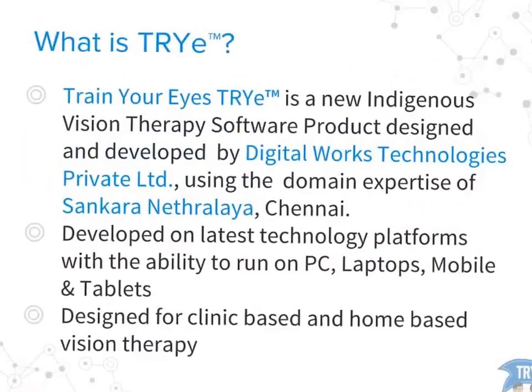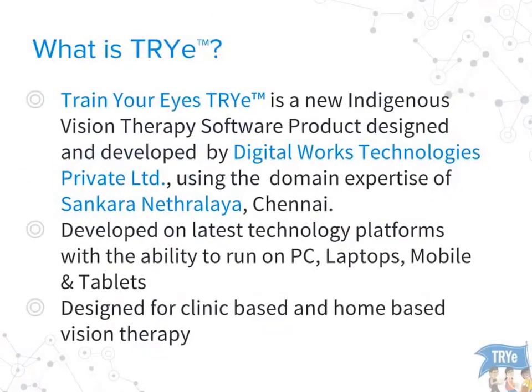What is TRYe? TRYe, expanded as Train Your Eyes, is a new indigenous vision therapy software designed and developed by Digital Works Technologies Private Limited using the domain expertise of Shankar Nethralaya. TRYe is developed such that it can run on the latest technology platforms such as personal computers, laptops, mobiles and tablets. And TRYe offers both clinic-based and home-based vision therapy at one shot.